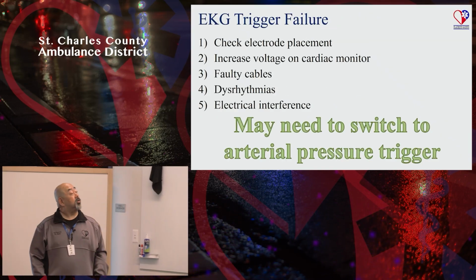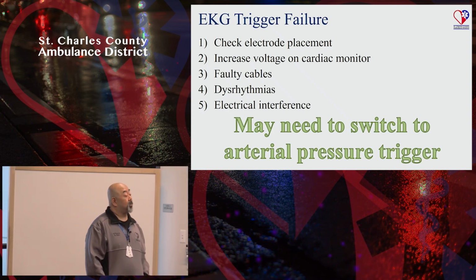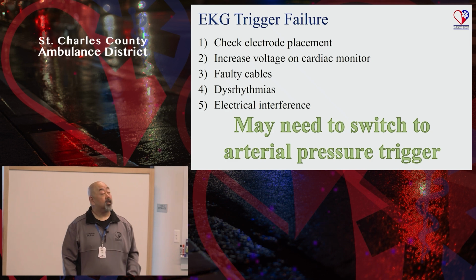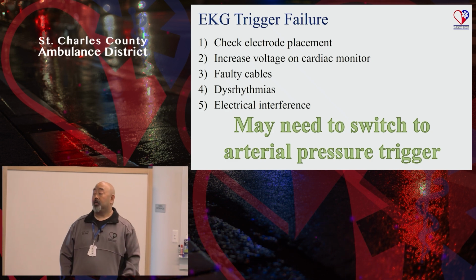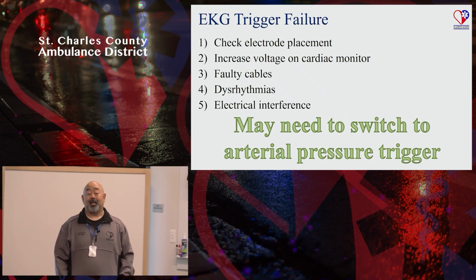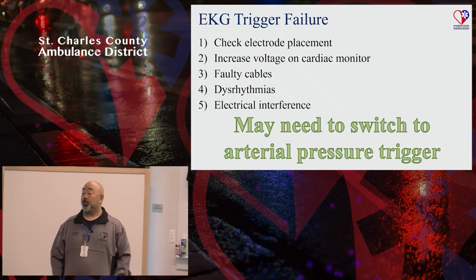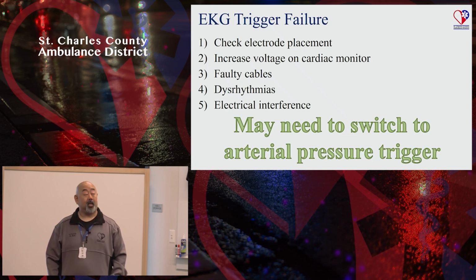Now, trigger failure is also often because, besides loss of the dicrotic notch, maybe your electrodes are off. Something as simple as making sure that every electrode is still picking up. It's the fundamentals, right? Like the first time we talked, getting back to just basics. All the fancy stuff is great, but just think about the fundamentals. Where are my electrodes? Are my cables connected? Cables squashed underneath the wheel someplace?